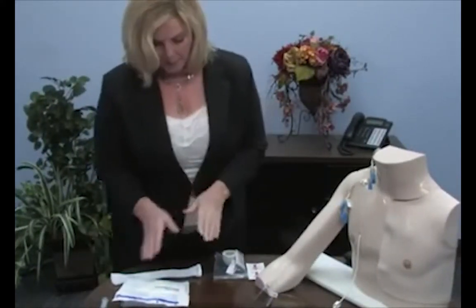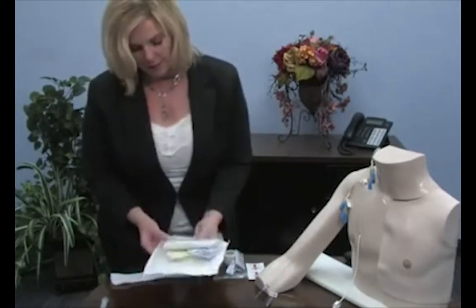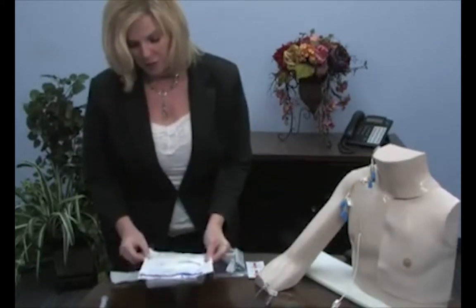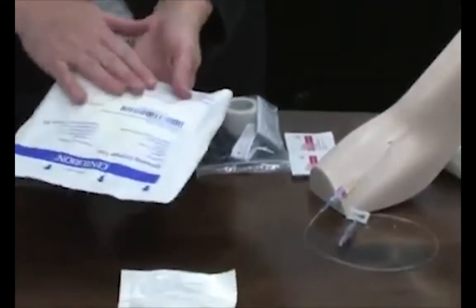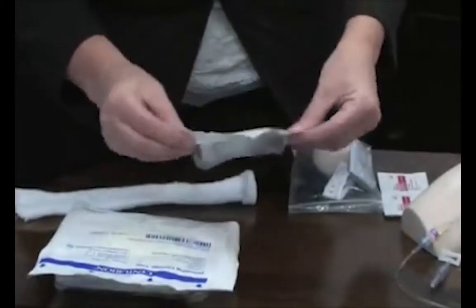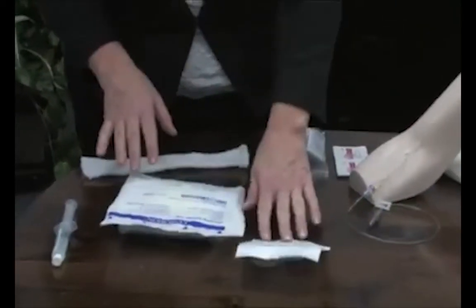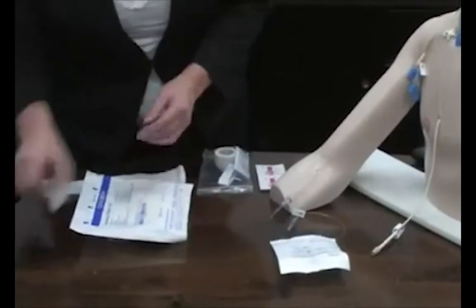When I am doing a line change and grabbing all my supplies, I inspect the supplies to make sure the expiration date is good and that there aren't any tears or wet spots or anything on the packaging. You want to make sure you do that so that you're not opening up something and using it on the patient that has had any kind of exposure to germs at all. So let's open up the packaging and get started.